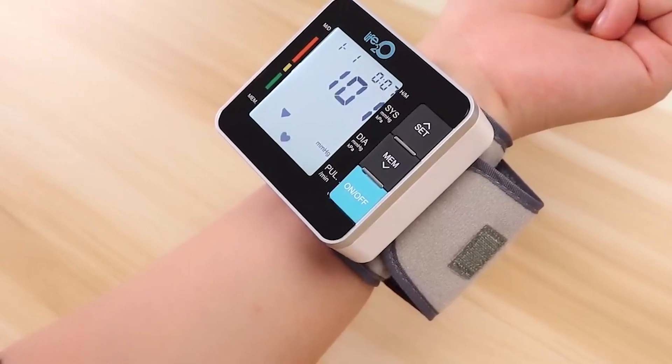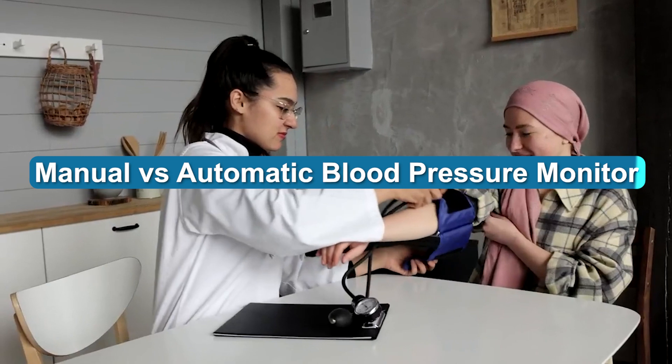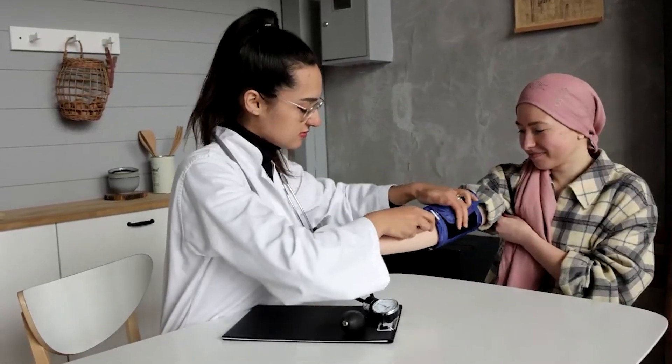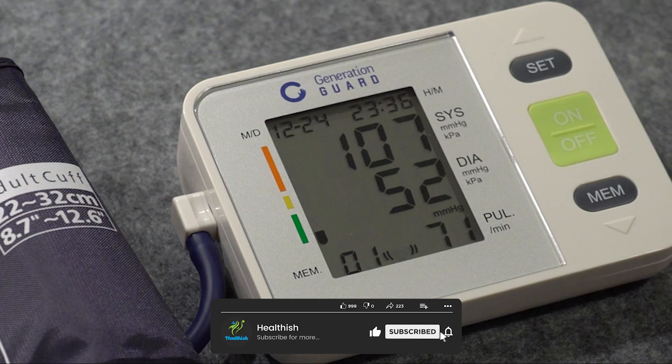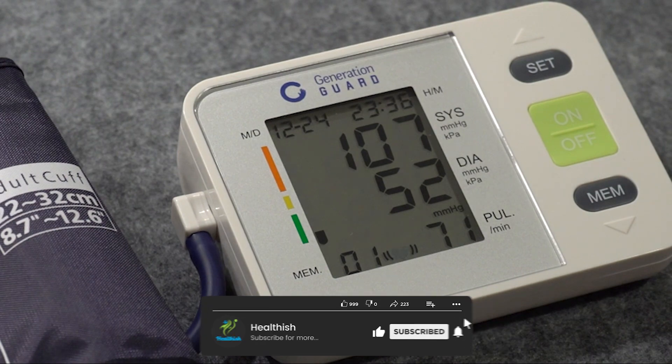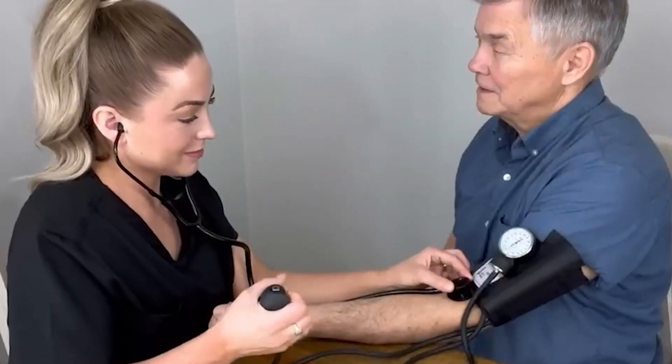There are a few things to consider when choosing between a manual and automatic blood pressure monitor. Manual blood pressure monitors are typically less expensive than automatic monitors. Automatic monitors are generally considered more accurate. However, some people prefer the manual option because it allows them to have more control over the reading.